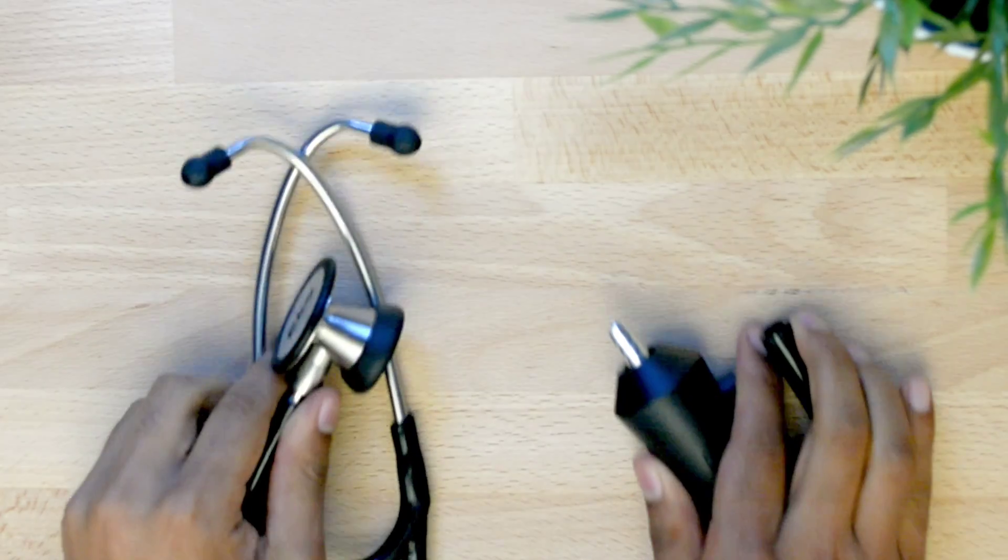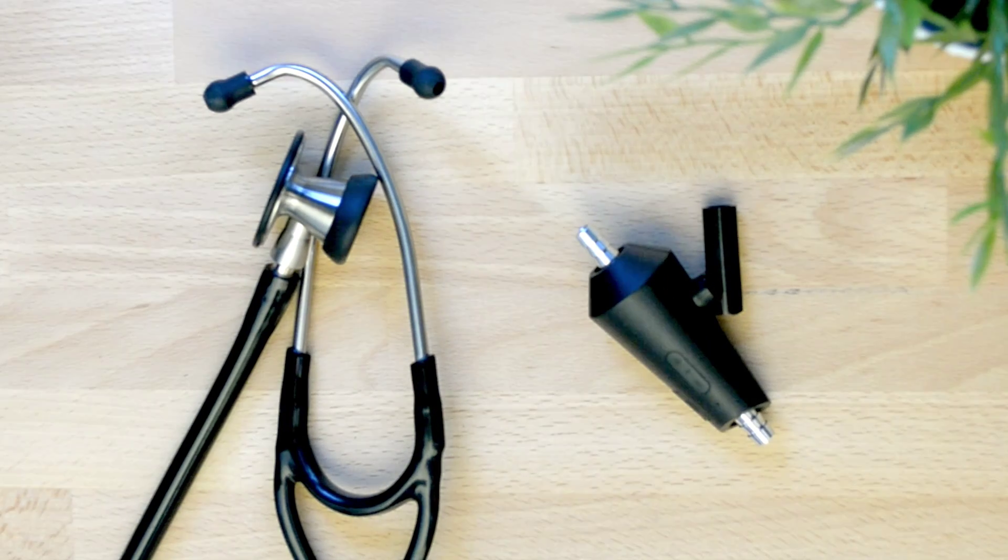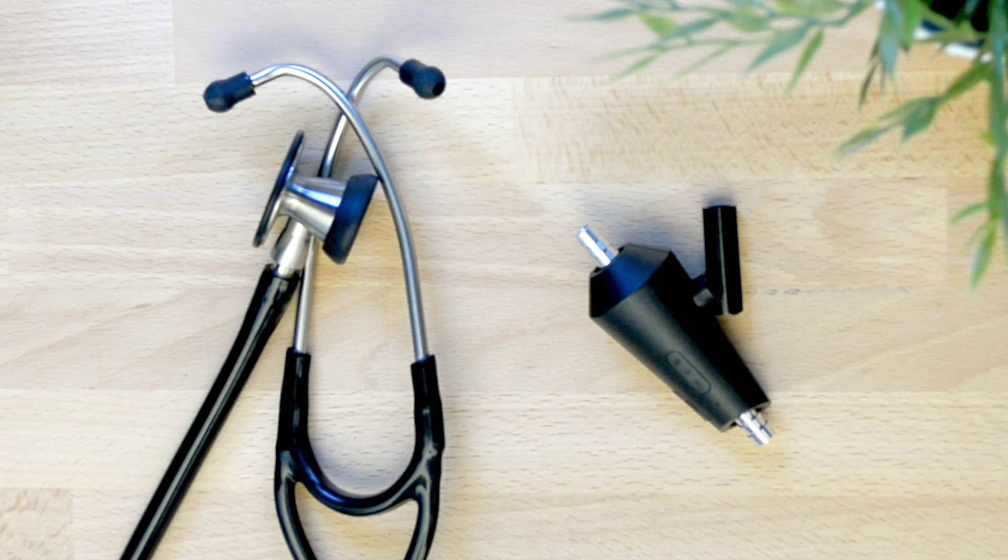Now let's attach the ECHO-Core to a large tube analog stethoscope. These steps are essentially the same, only here we will only be using the large adapter.